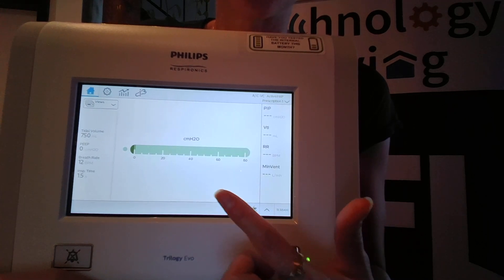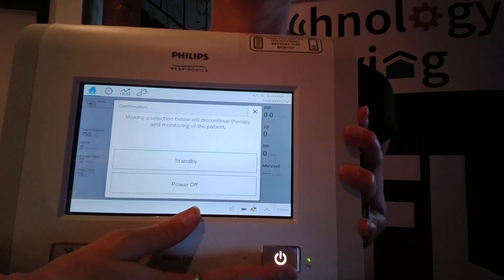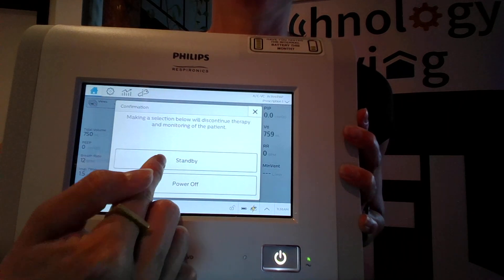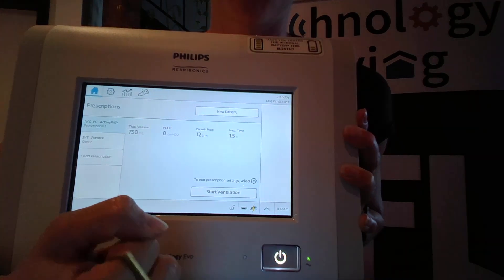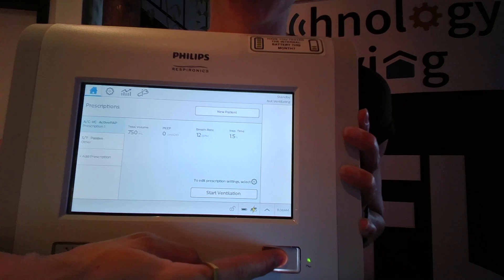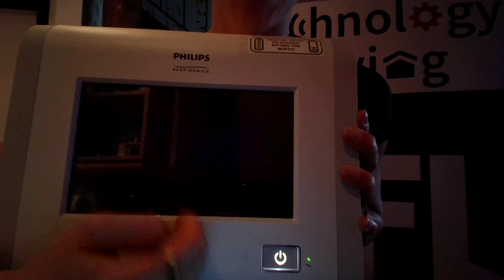Once it is running, to stop ventilation, you will press on the power button once and you will have the option to put the ventilator into standby or to power off the device. To power down the device, you'll simply press on the power button again and then select power off.